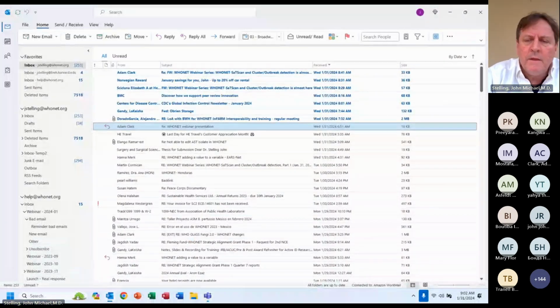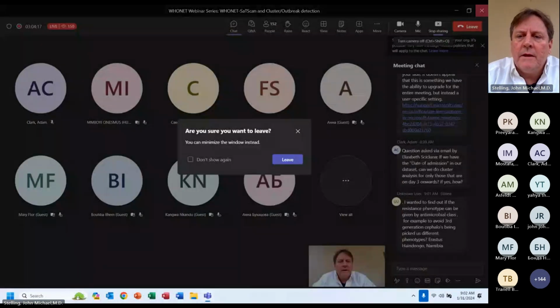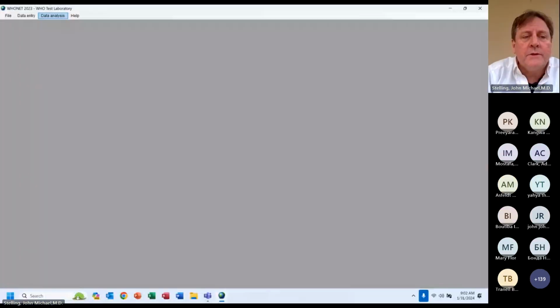Sharing my screen right now. Oh, I guess I was sharing my screen, sorry. Share screen, and let's see, WHONET. So this was also asked in a previous webinar. John, we can't see your screen. Oh, sorry, okay. Share. There it is, thank you. You can see the screen now? Yes.